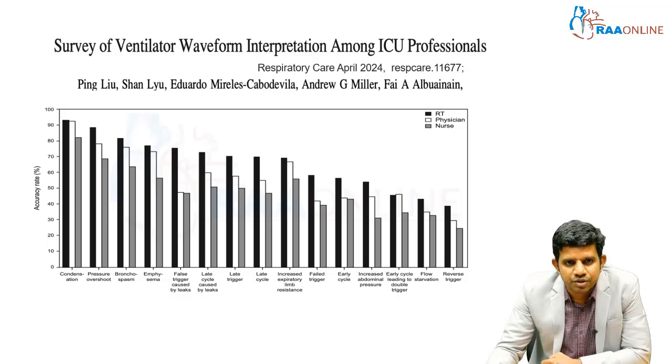But a recent survey published in 2024 found that less than 5% of ICU consultants understand the ventilator waveform appropriately. More than 90% of ICU consultants, the doctors practicing critical care, are not able to interpret the ventilatory waveform appropriately. They are not making appropriate interventions whenever they face a problem with the ventilators. So understanding of the ventilatory waveforms is very, very important.